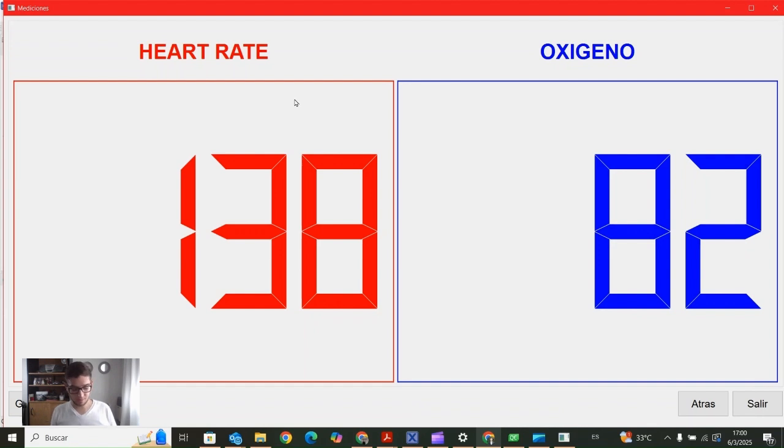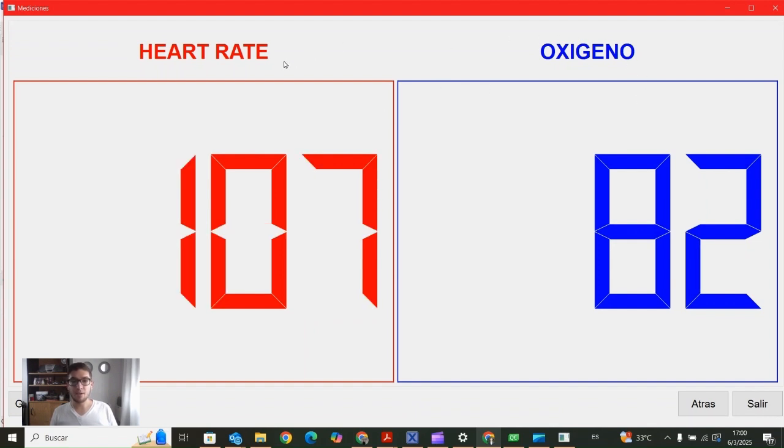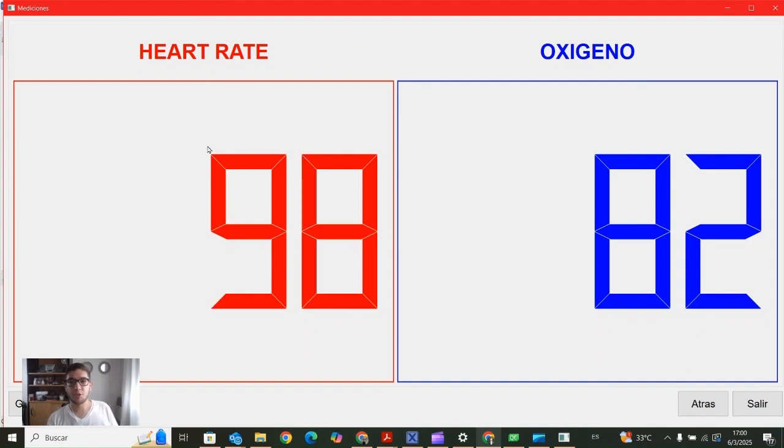As I said, as close as possible, but not so close. Another thing is that typically it will take about 1 or 2 or 3 minutes maybe to have proper measurements. Sorry, it takes a few minutes to calibrate everything and to have a more interesting measurement. As you can see, it is fluctuating a little bit.